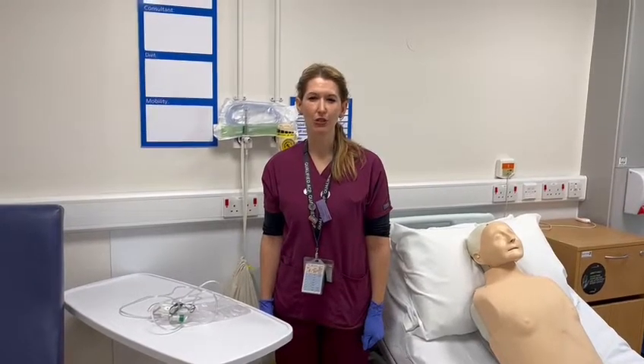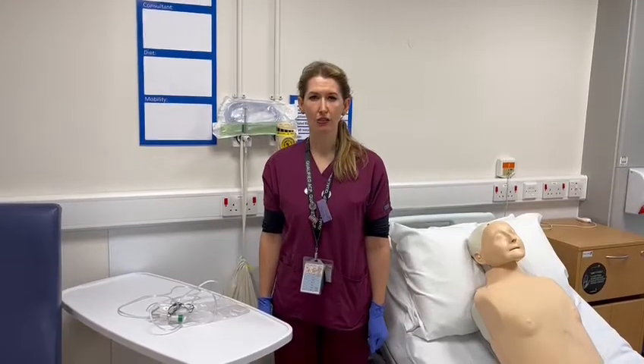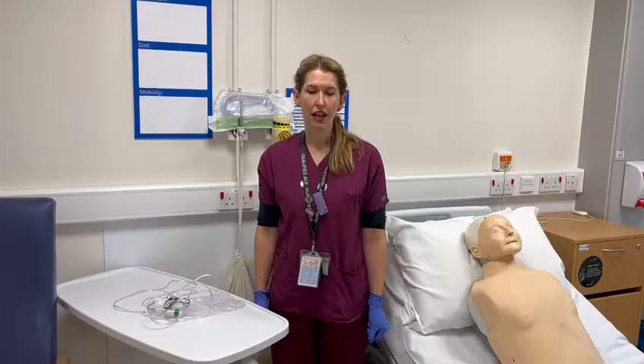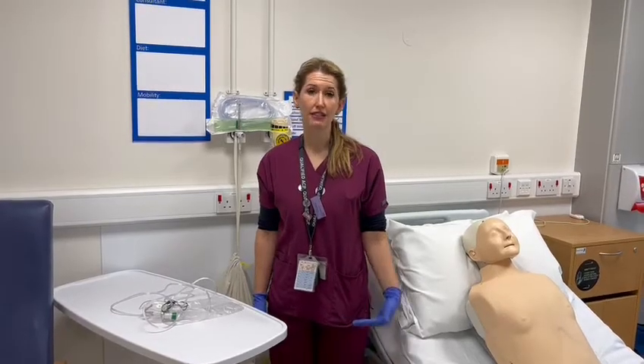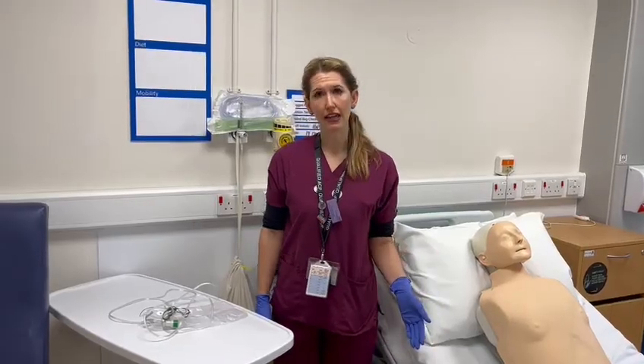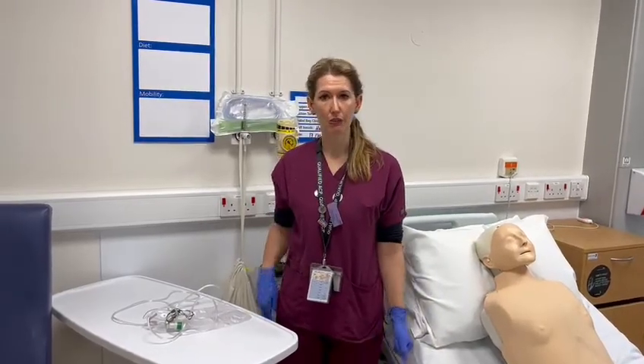Hello, my name is Kirsty Lang and I'm one of the respiratory ACPs here at Harrogate Hospital. This video is going to go through how to deliver oxygen through a non-rebreather mask. The situations where you're likely to need this is where you've got a deteriorating sick patient, so you recognise that your patient is really sick and you need to apply 15 litres non-rebreather.